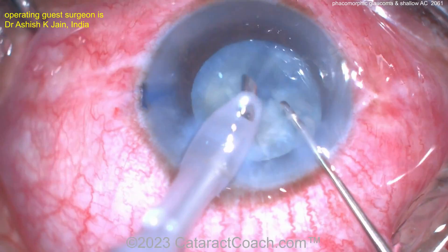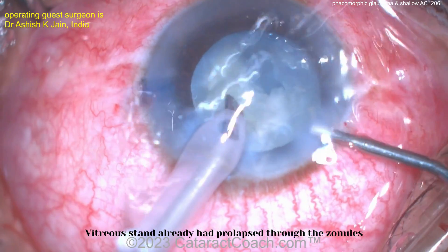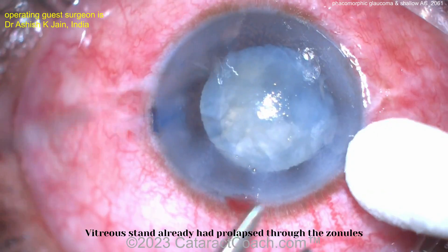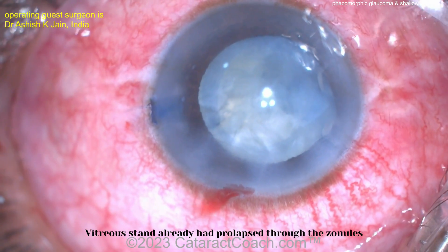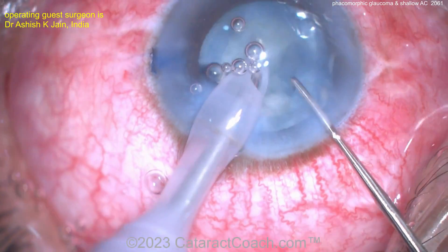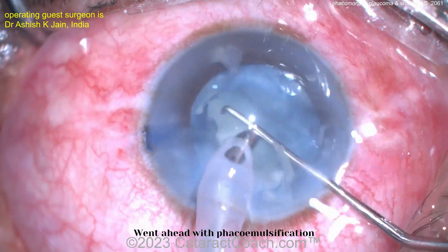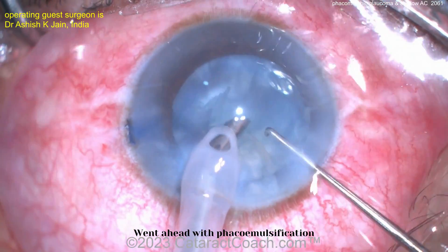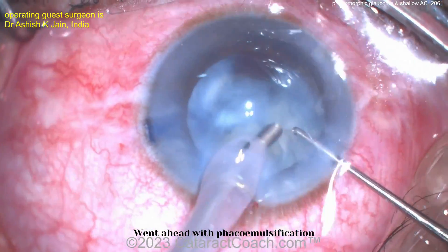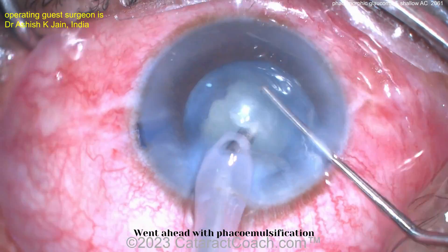When we take out this extra-thick human crystalline lens — this cataract — and replace it with a thin IOL, you can have a much better result and resolve the issue. A vitreous strand is already noted. There's some significant zonodialysis here because the vitreous is coming around it. Getting the nucleus out of the eye. We've got to clean up that prolapsed vitreous — we'll have to put some triamcinolone on to see where it is.